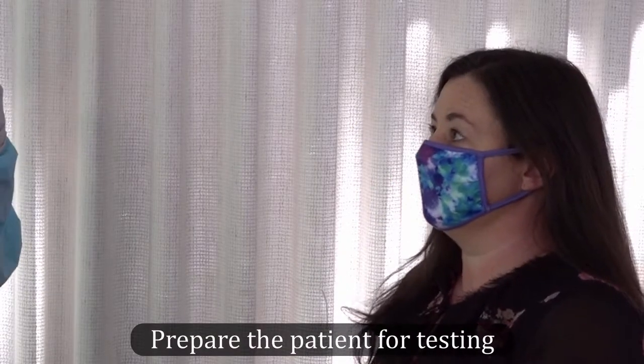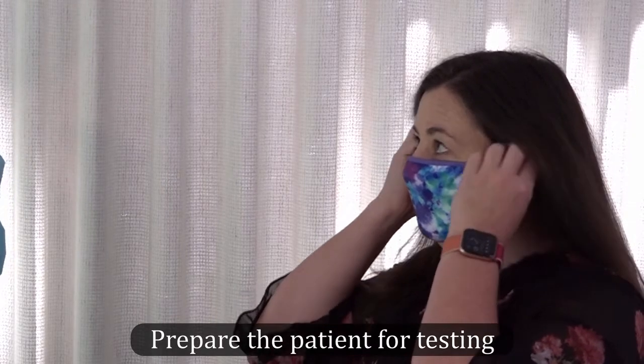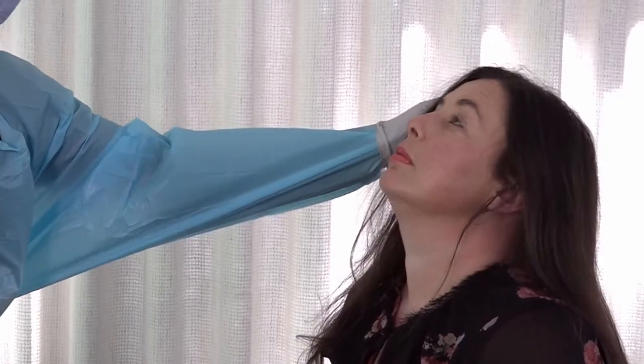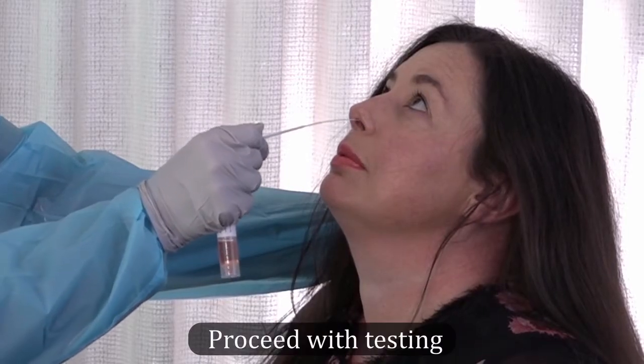The patient should be seated in an upright position. Ask the patient to tilt their head back to enable insertion of the swab at the proper depth to collect the specimen. Tilt the patient's head back 70 degrees.